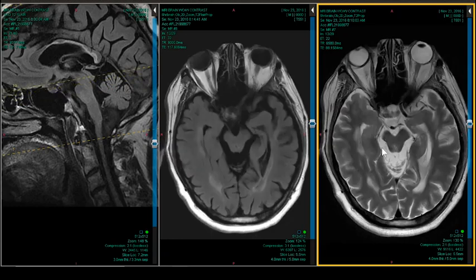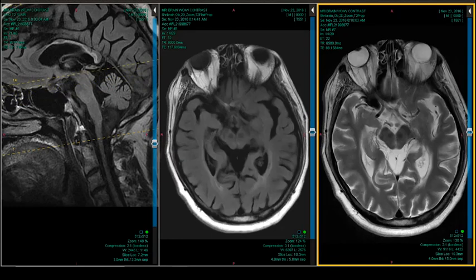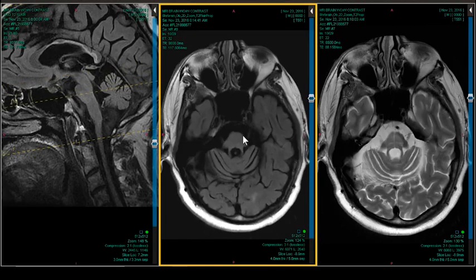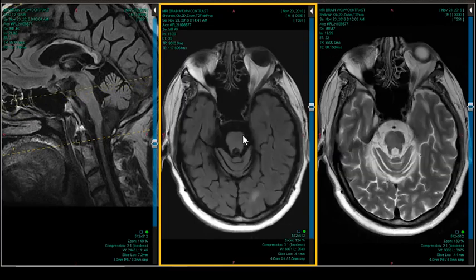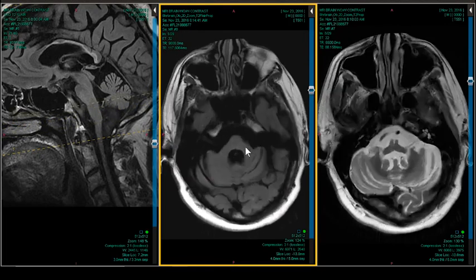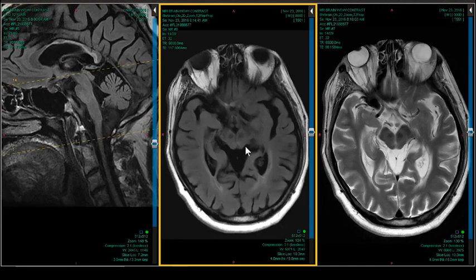So let's take a look at the red nucleus in this one. Pretty small. There it is right there. Small but present. And as I said earlier, the inferior olive is almost non-existent. The olivary protuberance is flat. The olivary sulcus is non-existent. So involvement of that triangle, not pathognomonic, but characteristically seen with this disease. And the myoclonus is horrible.